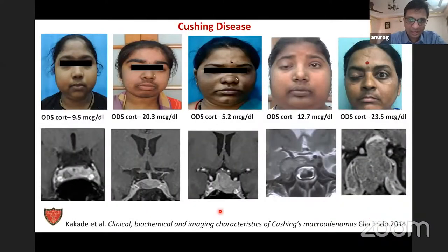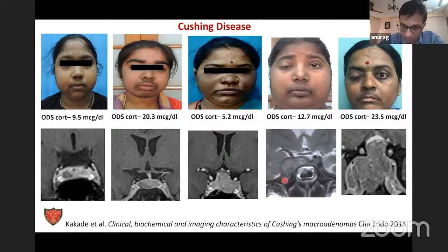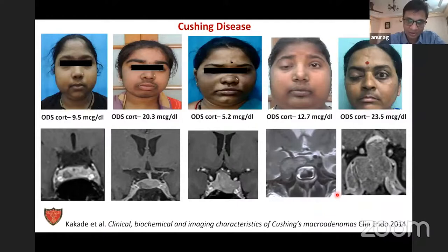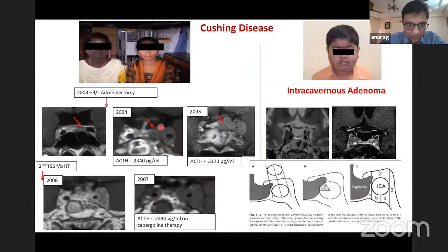In Cushing's disease, tumors are classically micro or 'pico' adenomas, often not visible, requiring dynamic contrast to localize. This is a microadenoma, while a macroadenoma is easier to diagnose. One lady had cavernous extension and apoplexy presenting with ptosis. Another lady was a case of pituitary carcinoma with a large macroadenoma in Cushing's disease with liver metastasis. A post-bilateral adrenalectomy patient had a microadenoma turning into a growing cavernous adenoma with rising ACTH — Nelson syndrome.